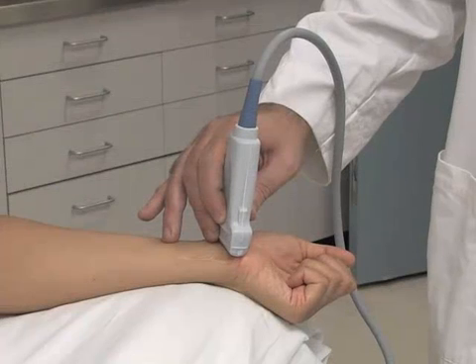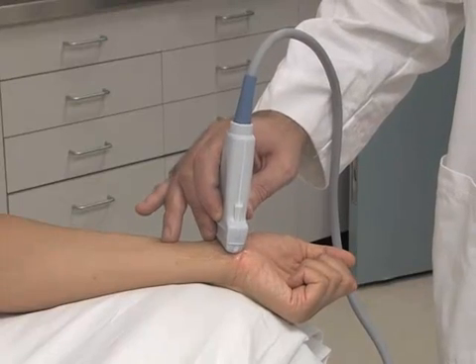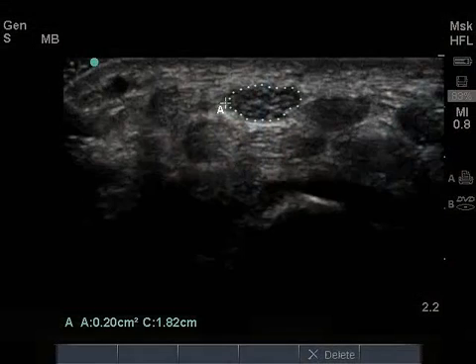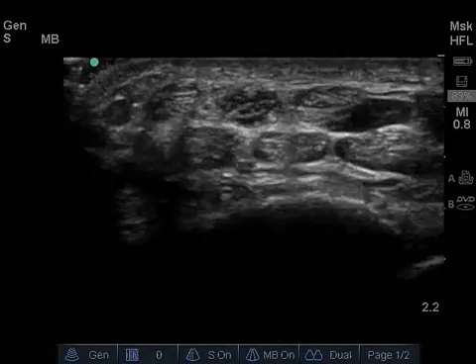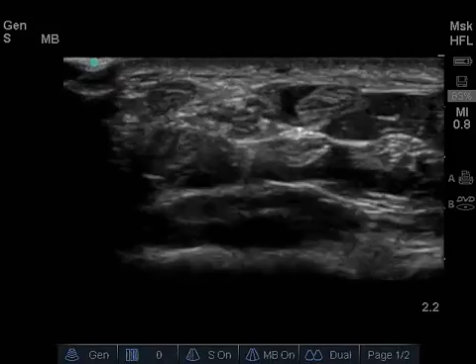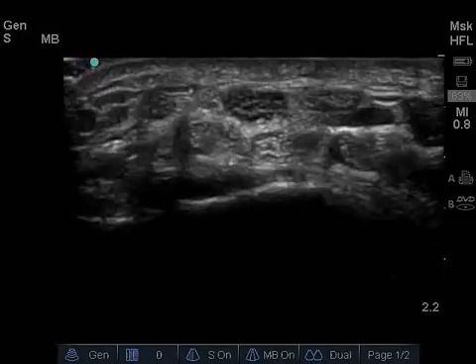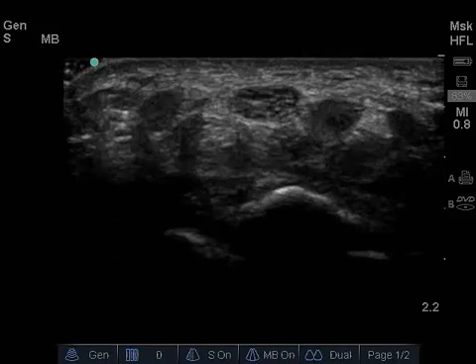You perform an ultrasound evaluation of the volar surface of your patient's right wrist. Transverse imaging of the median nerve at the proximal carpal tunnel reveals a hypoechoic and enlarged median nerve with a cross-sectional area of approximately 20 mm square. You prescribe anti-inflammatory medication and a wrist splint during sleep to treat her for carpal tunnel syndrome. Ultrasound-guided corticosteroid injection may also be considered.